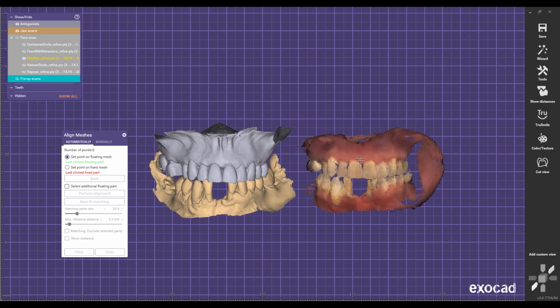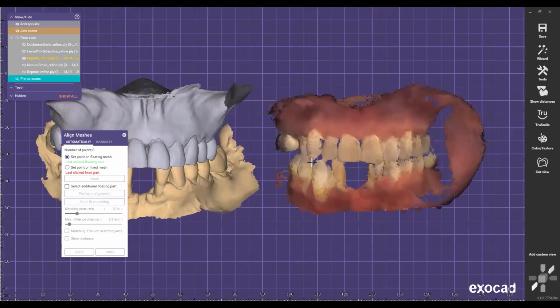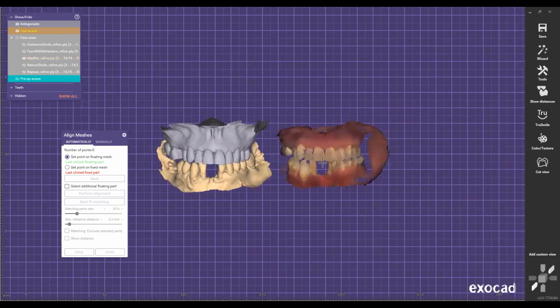So we use our facial scanner to scan the bite, utilizing our Insta retractors at the same time. And we just go ahead and scan the patient in MIP or an open view. We put a lip gauge there, and then we scan the bite like that. We're able to capture all that information in one shot, so we're able to align our bites to it.